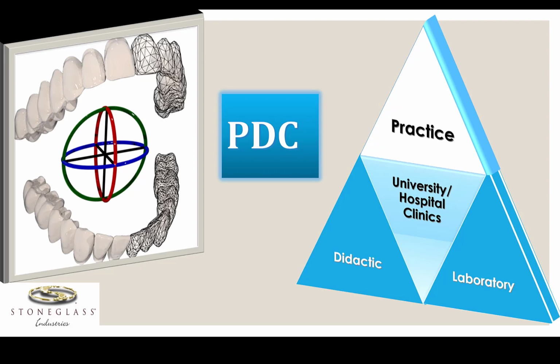The workflow follows the logical analog progression and can be verified in the same way. The versatility of the software allows for intraoral scans and tabletop scanners to be used to input patient data to be integrated into the virtual articulator and for the user to be able to print any design they develop. This independence serves to reduce costly redos and time while determining the best prosthesis design for the patient. The data can be electronically sent to the manufacturer, where both biomechanics and aesthetics can be united within the design using high quality materials and manufacturing practices led by expert technicians and engineers.